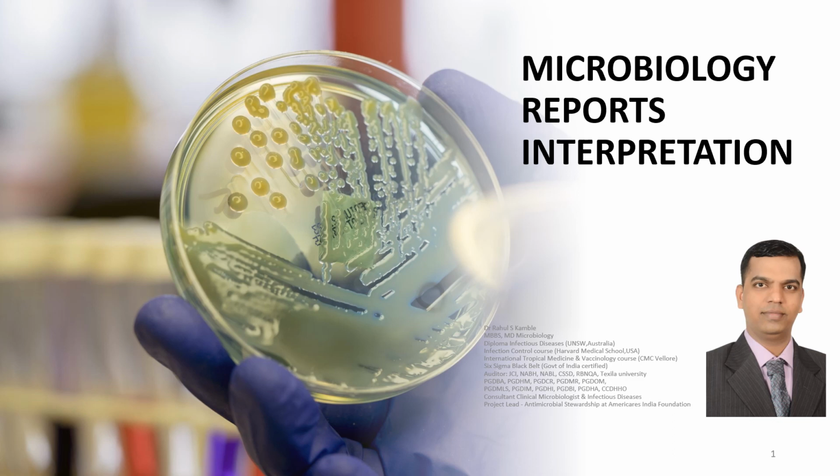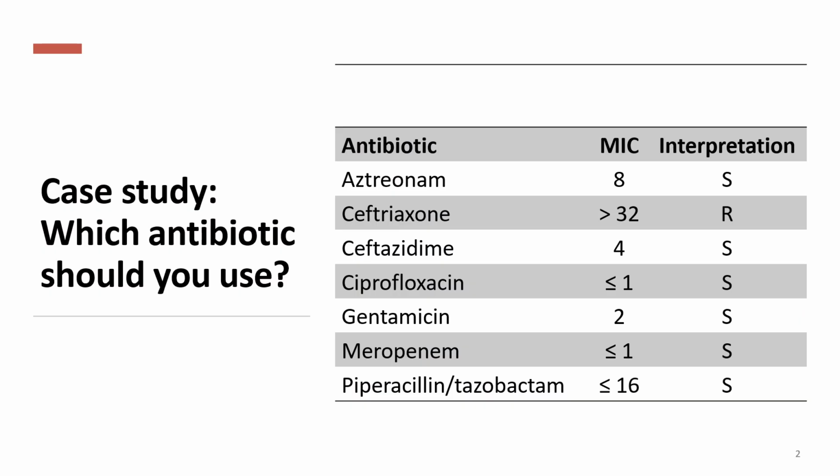Let us continue with our session on microbiology reporting interpretation. Let us understand how to interpret two examples of some case studies. When a microbiology report is released, we get to see various antibiotics are sensitive. Now, how to see which antibiotics should we use?